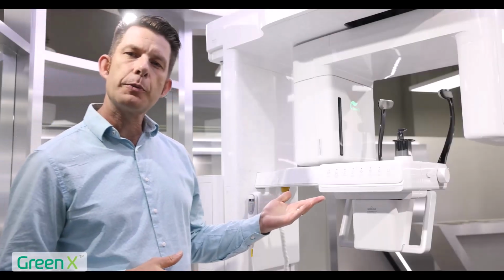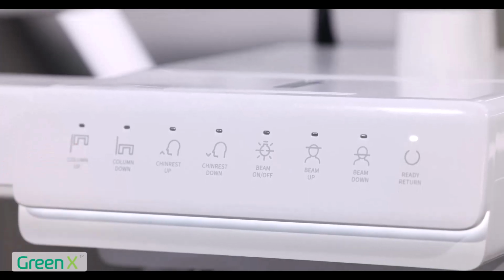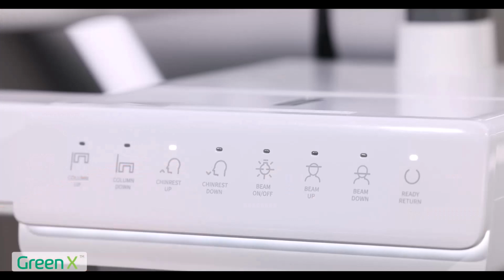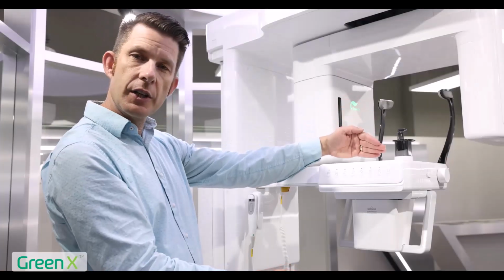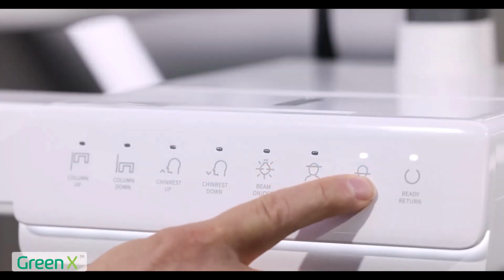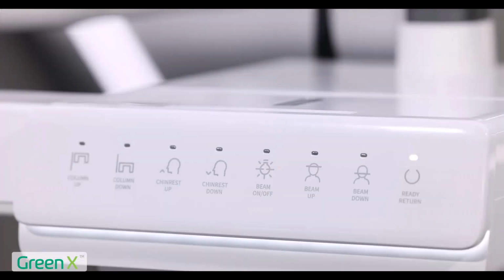Let's talk about the touchpad. On the front of the device, you have your column up and column down buttons. You also have your chin rest up and down, your beam on and off, which toggles on your positioning beams, beam up and beam down, which is going to be for your Frankfurt horizontal beam, and lastly, once you have your patient positioned, the ready return button.